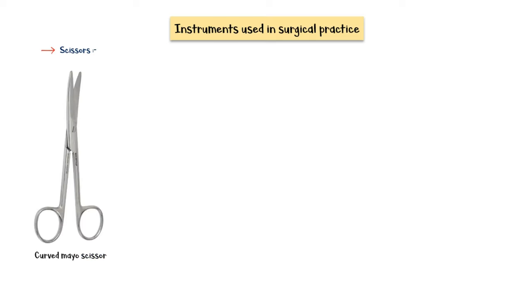In this video, I'm going to discuss some common instruments used in surgical practice. Let's start with scissors. Many different types of scissors are used in surgery. Mayo scissor is one of them. They can be either curved or straight.